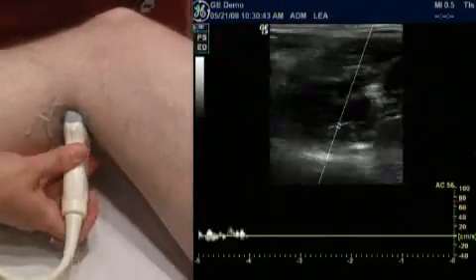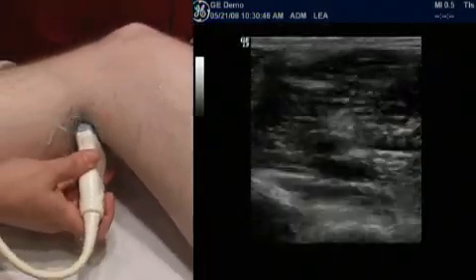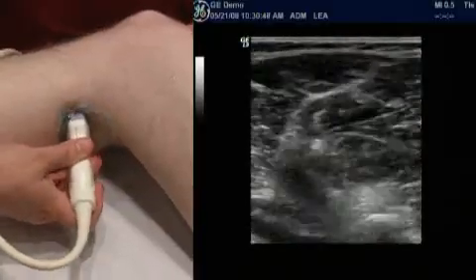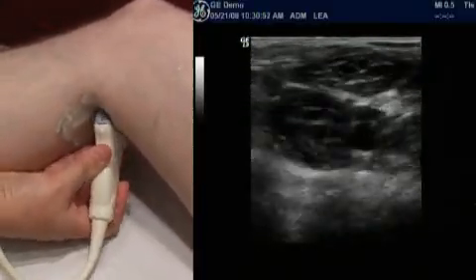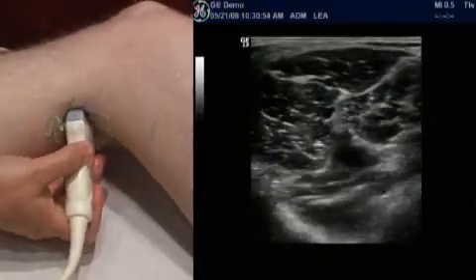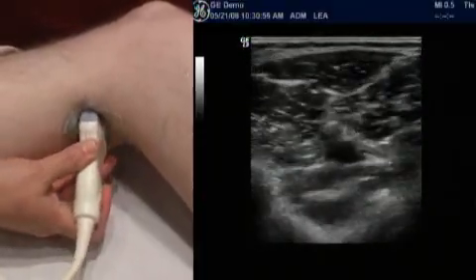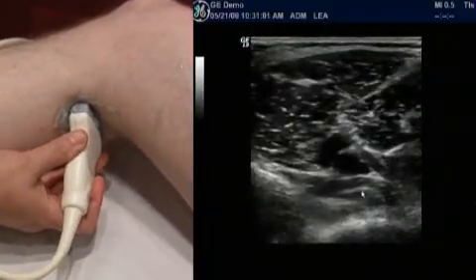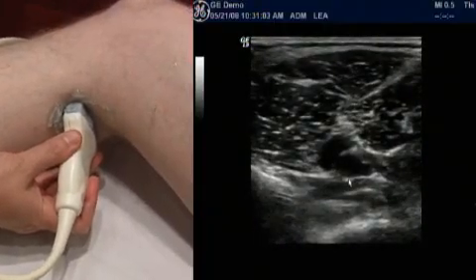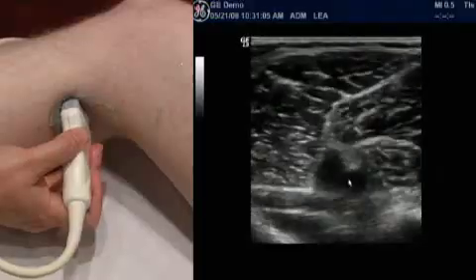So most folks record just a representative signal from the popliteal. Coming down, we'll come back to the anterior tib in a little while. Once you see the anterior tib branch off, now where we're at is really the tibial peroneal trunk. And that's a varying length.